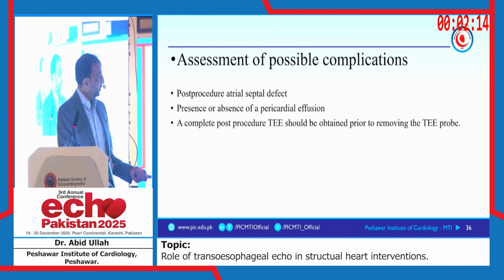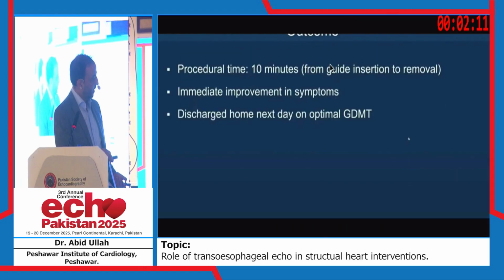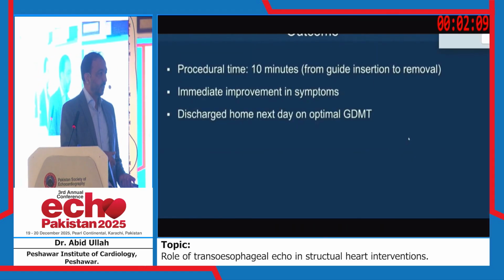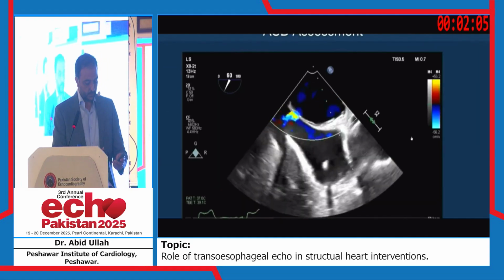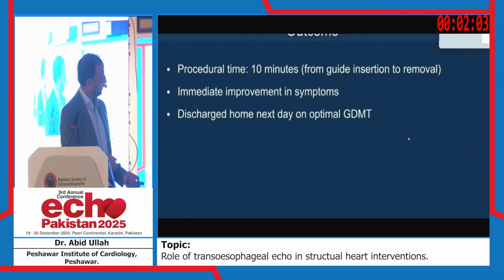Any possible complications? We'll put some color on the interatrial septum. If there is a large ASD, you might want to close it. Majority of the time, it's not needed to be closed. 2 minutes remaining.